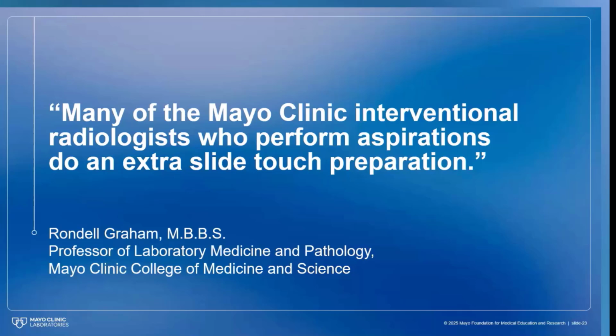And we see another quote here from Dr. Graham, who is a pathologist. Not all the procedures are done by endoscope or minimally invasive means. Many times they are done by interventional radiologists who perform a percutaneous biopsy for a lesion, likely a more peripheral lung cancer lesion. So our pathologists and many of the Mayo Clinic interventional radiologists who perform aspirations do an extra slide touch preparation. Let's see Katie's interpretation of this quote.